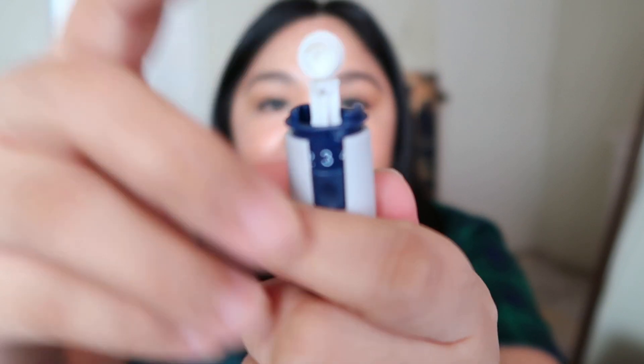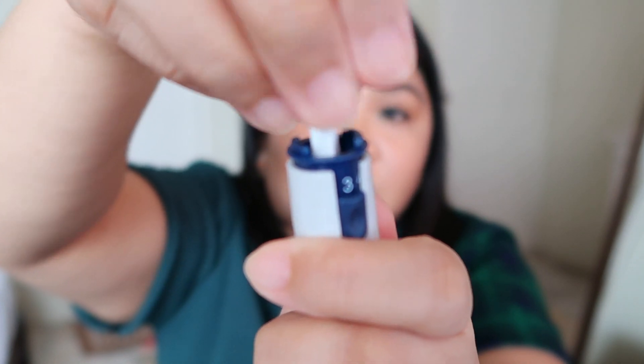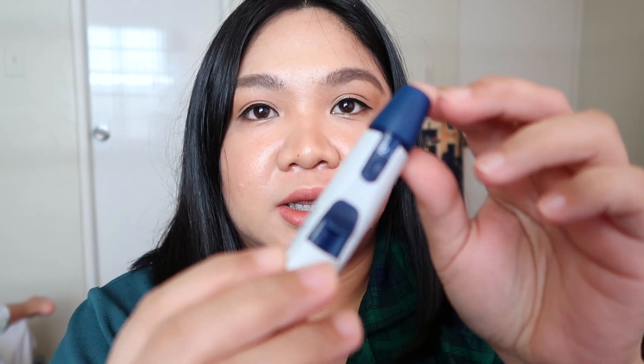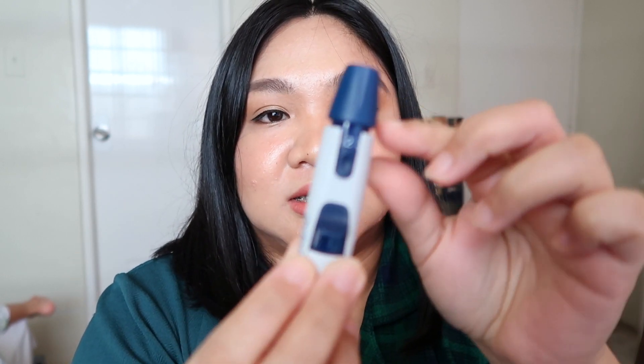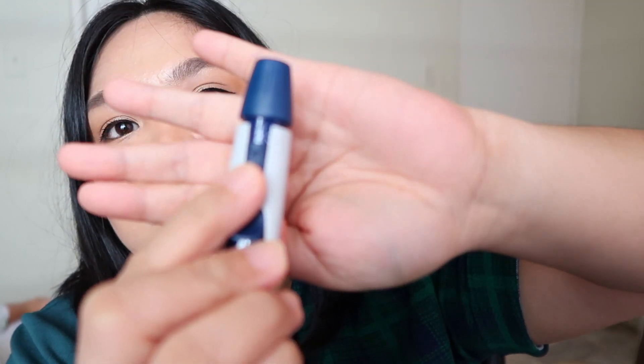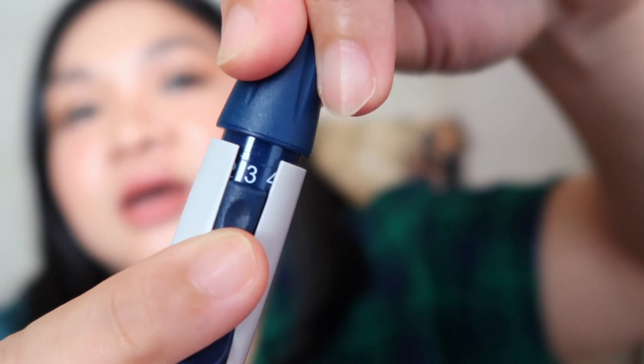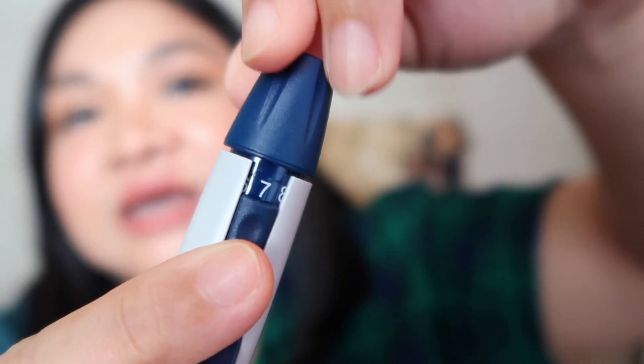Once you're done, that's when you twist the cover to prevent accidentally getting poked or contaminating the needle. Once the needle or lancet is inside the lancing device, just simply cock it. You can also adjust the needle depth — there are numbers on it. The higher the number, the deeper the puncture.